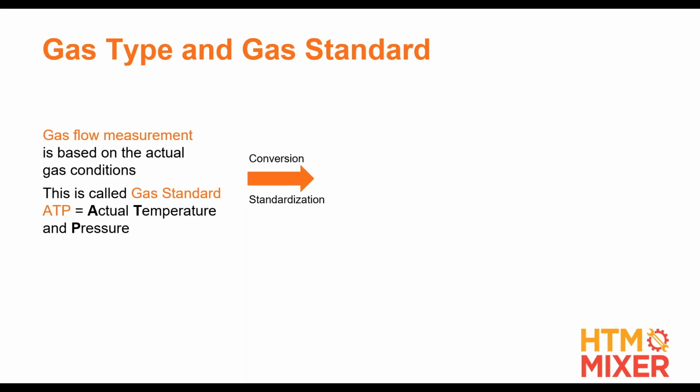Because we know sometimes it's going to be dry and at room temperature, and other times it's going to be humidified. Sometimes it will be room temperature, maybe, or colder, coming from devices that use wall air systems or oxygen bottles. If you have a blower-based device, that naturally heats up the gas, right?